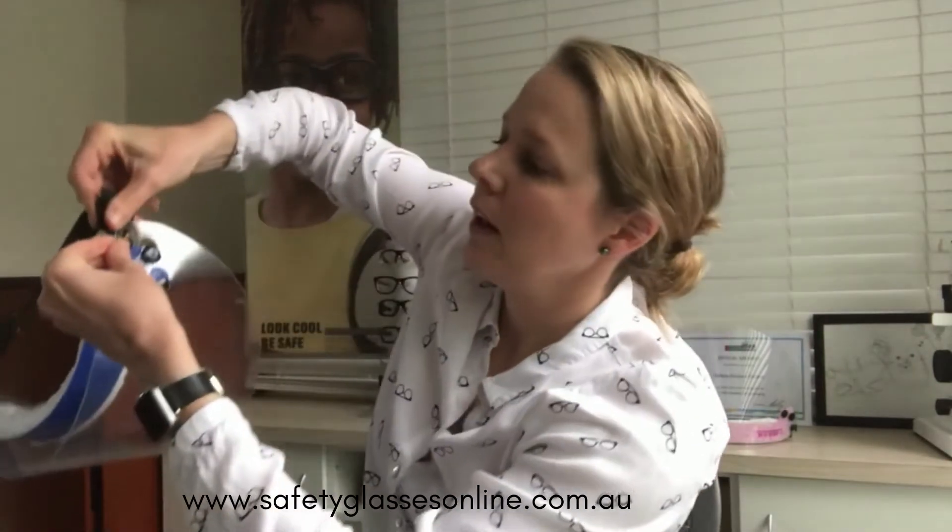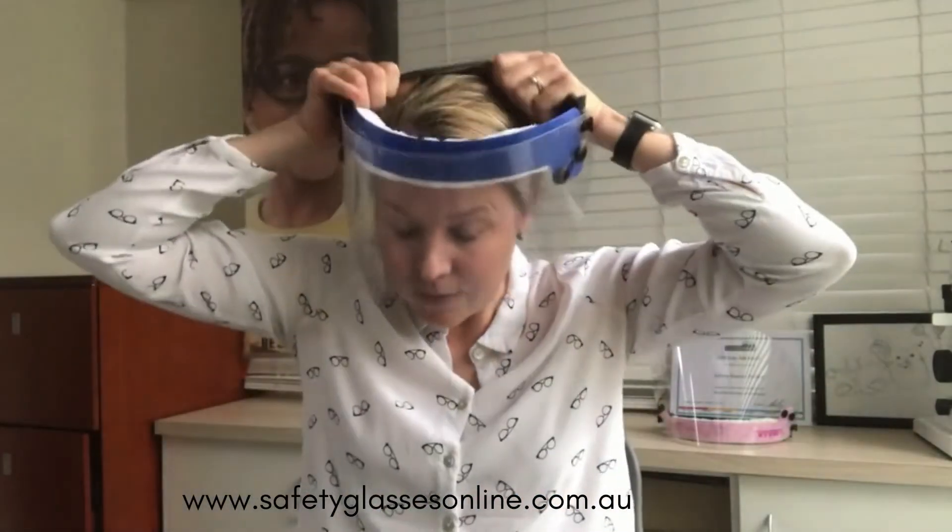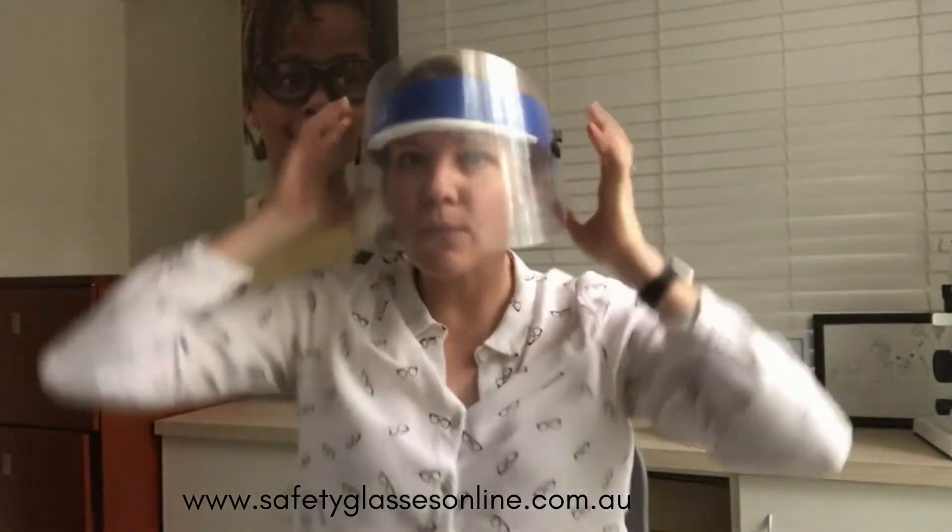Then attach through the holes — you just put it in the big hole, slide it through the big hole, and then pull it through to the little hole, and there you have it. That is ready to go — as easy as that.